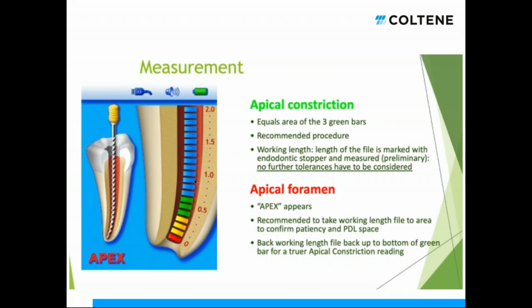Hey, does it always show? Question, Pearson. Go ahead. Does it always show three green and three yellow? I thought that was dependent upon the measurement of the tooth? Nope. It's always three green, three yellow, one red. Okay.